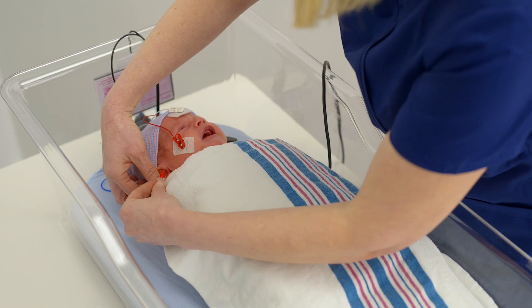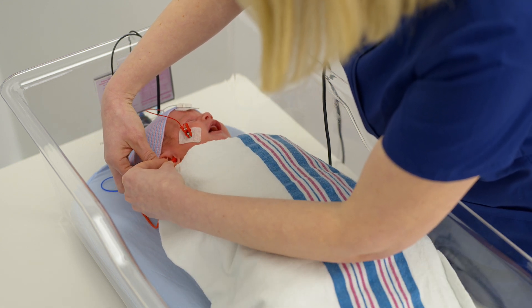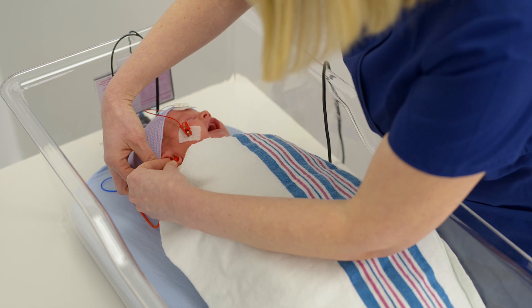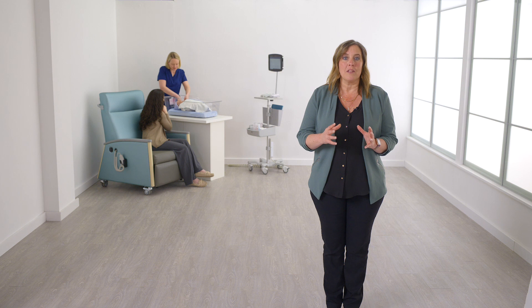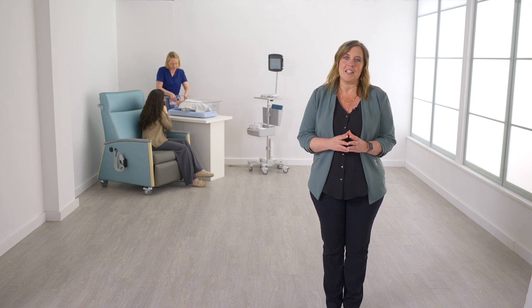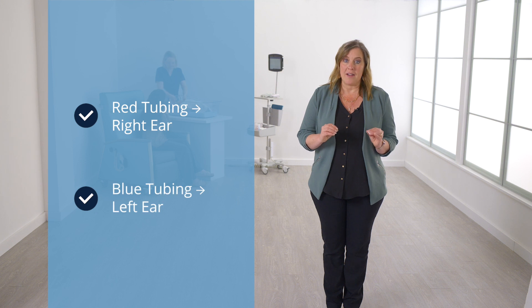Next, pull gently down and out on the baby's ear lobe to open the right ear canal. Aim and insert the tip connected to the red tubing gently but securely into the baby's ear canal. Release the ear lobe and ensure that the ear tip is firmly in place and will not easily fall out. Repeat this process for the left ear with the ear tip connected to the blue tubing. It is critical that the insert with the red tubing is placed in the right ear and the insert with the blue tubing is placed in the left ear.